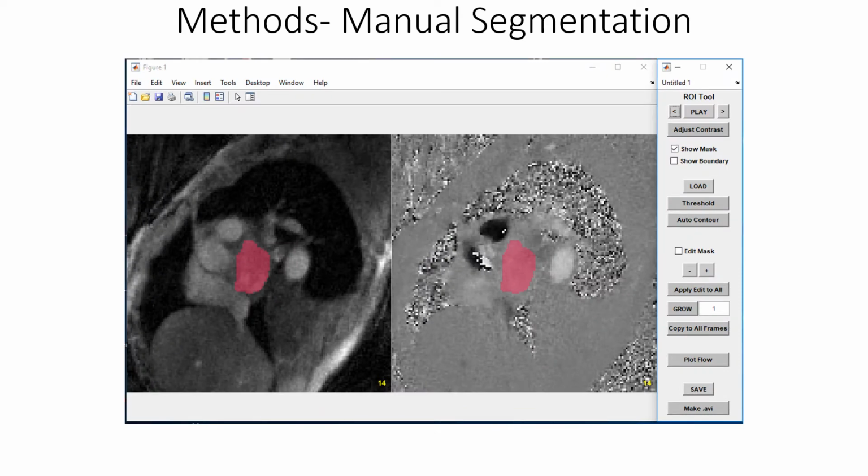You can probably note within that demonstration there were slices that were missing parts of the left atrium or extended beyond it. The bulk of the time segmenting came from manually reviewing and changing these slices. This is important for two reasons, as the majority of the segmentation comes from a region growing algorithm with user input that should be easy to learn, and the rest comes from cleaning it up, which may be harder and require the deep learning complexity.